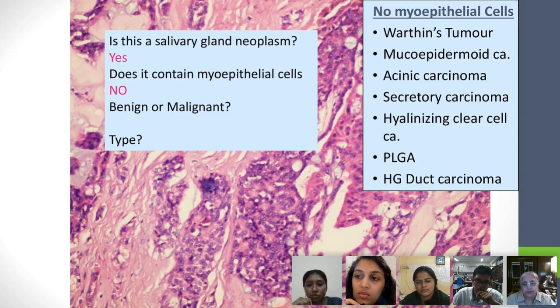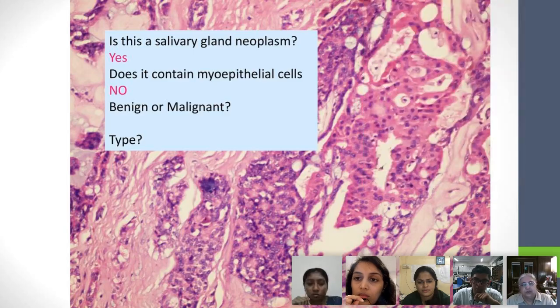Of course, mucoepidermoid tumors don't produce papillary structures, and we never found a single mucinous line. In this case, it may not be there because we are talking about the previous, excised salivary gland tumor. A mucoepidermoid tumor will never produce papillary structures. Look at this.